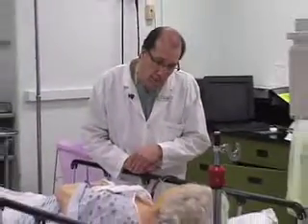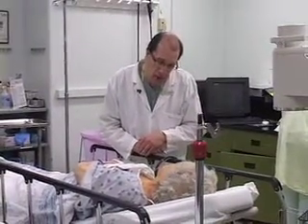Everyone's familiar with ultrasound. Almost everyone has had an ultrasound procedure so far in their lives. And the new technique of endoscopic ultrasound is taking that external body experience of having a probe scanning over their abdomen or their chest or wherever, and attaching that probe in a new, smaller, compact way to the end of an endoscope. An endoscope is that special camera that we can put into people's bodies, either through the mouth or through the anus, and look inside the lining of the GI tract.